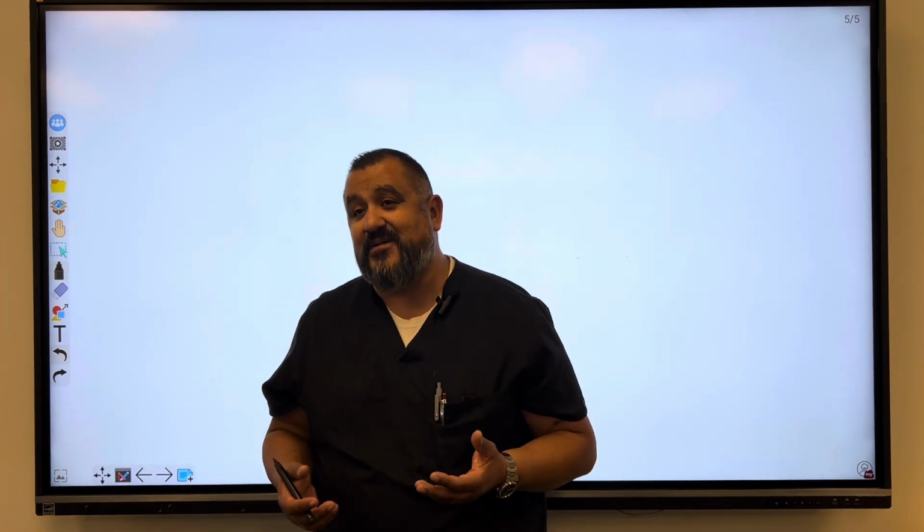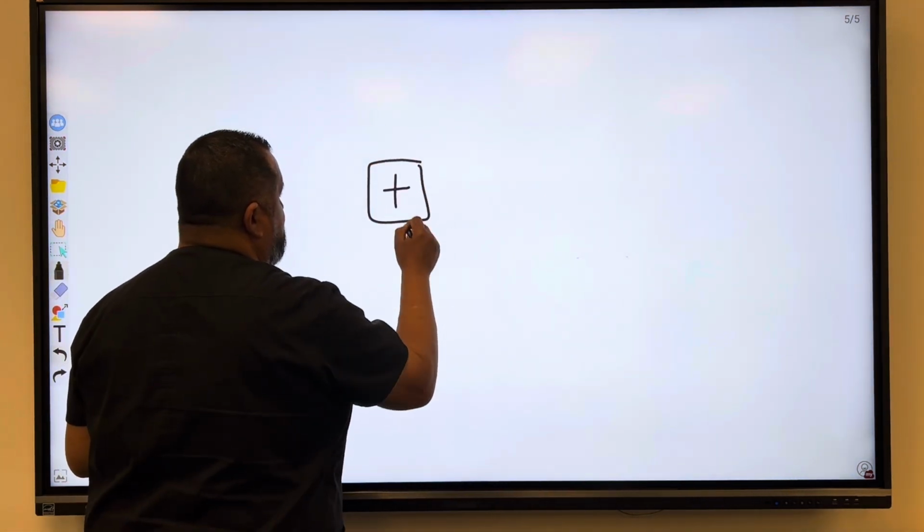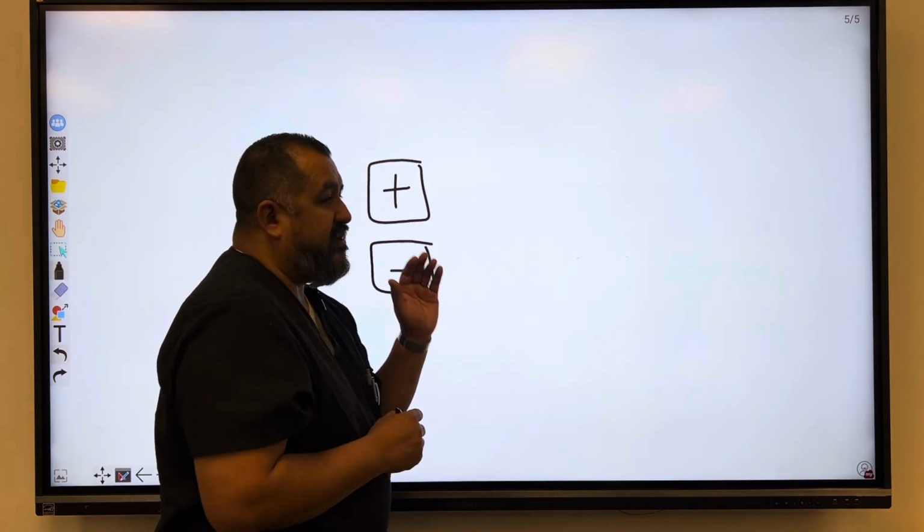Now, the other thing is pathologies, and this is why I don't really use AEC systems as much as I should. I know how to use them, but the system doesn't know how to accommodate for pathologies. So if it's a patient with congestive heart failure, and you know that in advance, you would have to hit the plus density button. Sometimes you see these buttons like this. Well, when you hit the plus density, the exposure time is going to be about 25% more. So it'll be 25% more that's going to be required for the exposure.